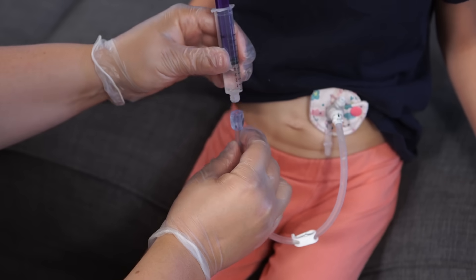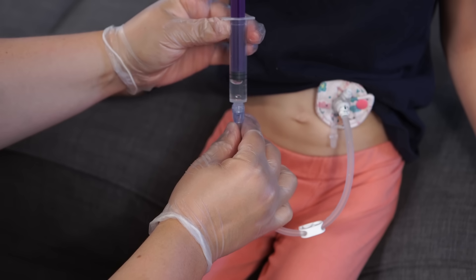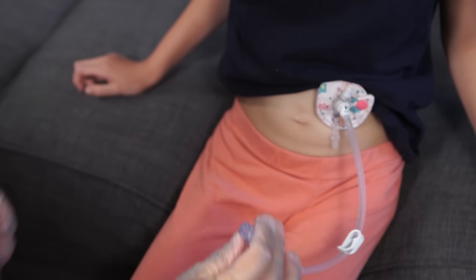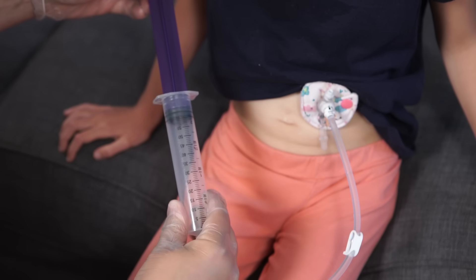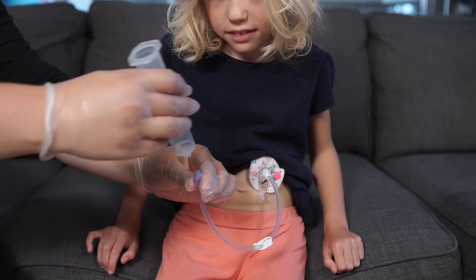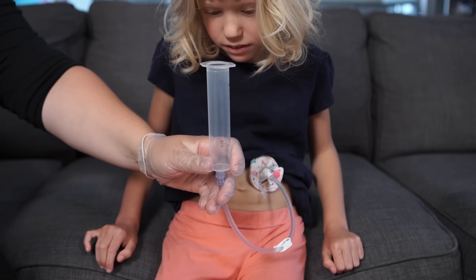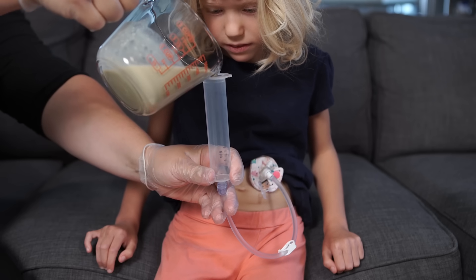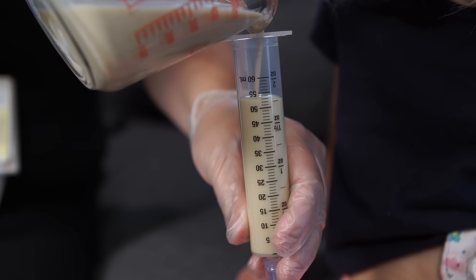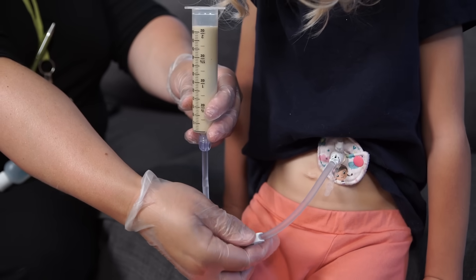Flush the feeding tube with the prescribed amount of water. Remove the plunger from the large syringe and attach the syringe to the feeding tube or extension. Hold the syringe at or above the level of the patient's stomach, then pour the formula into the syringe.